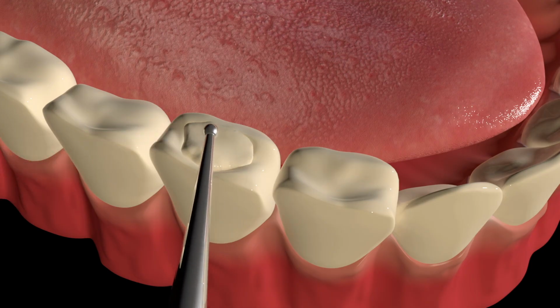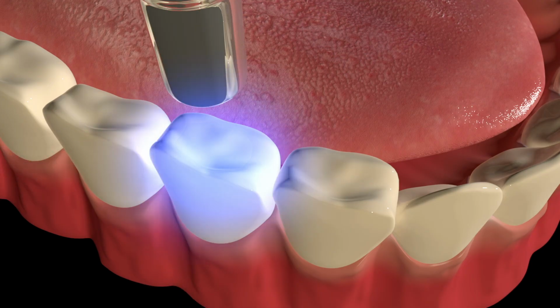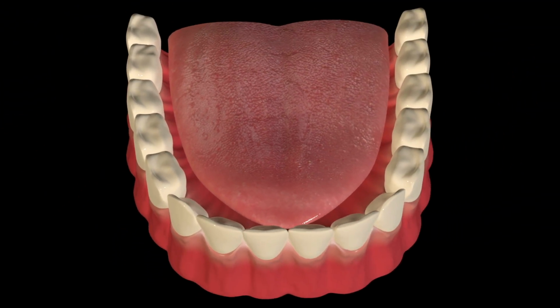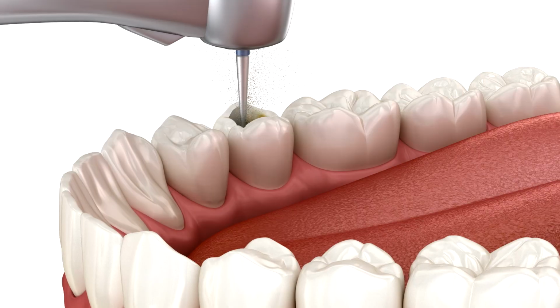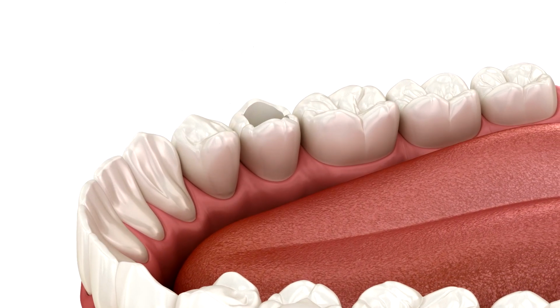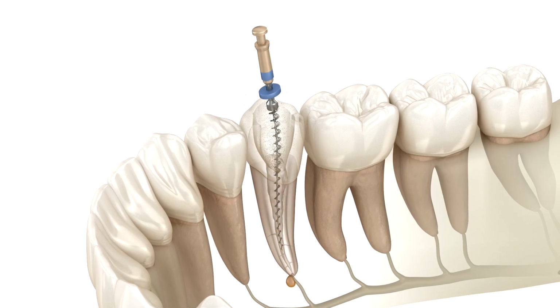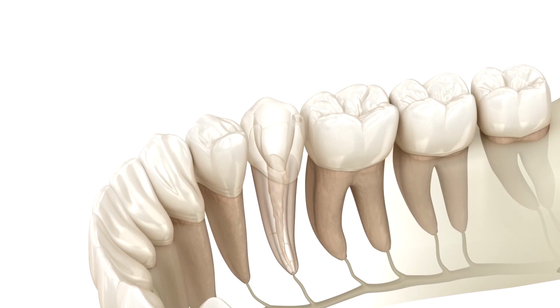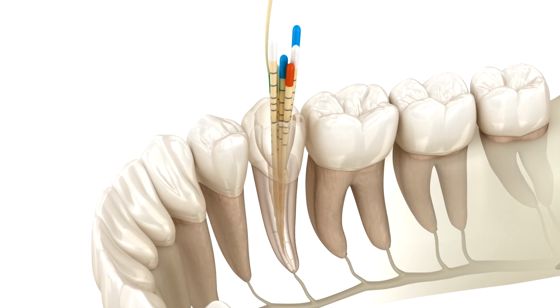The cavity filling procedure starts with tooth decay removal. Your dentist uses high-precision instruments, a stage often referred to as tooth drilling, to clear away infected tissue. As we see in this tooth restoration sequence, the goal is to create a sterile environment for the dental filling. Unlike invasive oral surgery, this dental treatment is focused on preserving as much of your natural tooth structure as possible.